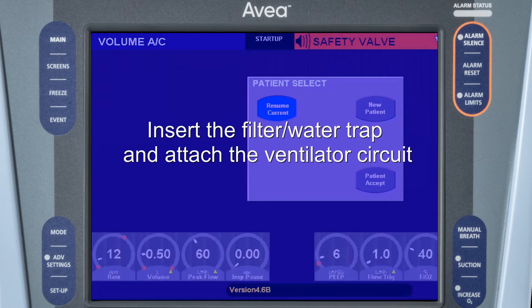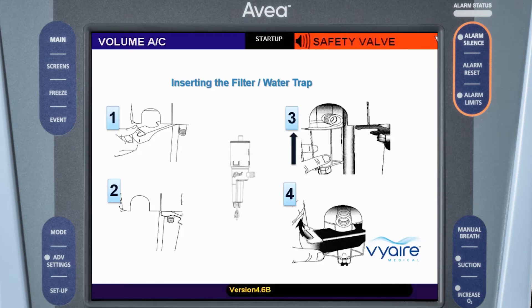We're going to begin by inserting the filter water trap and attaching the ventilator circuit. To insert the filter water trap, first swing the latch completely out of the way. Then insert the filter with a straight vertical motion, being careful not to break it, and finally close the latch completely.